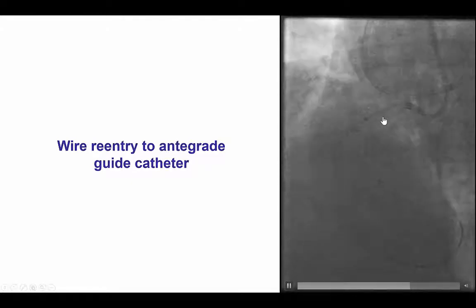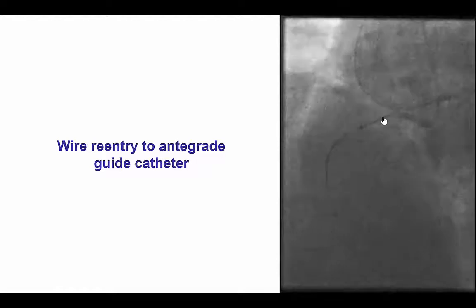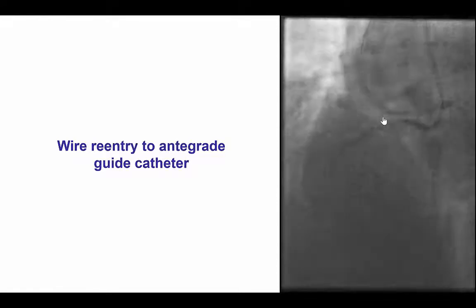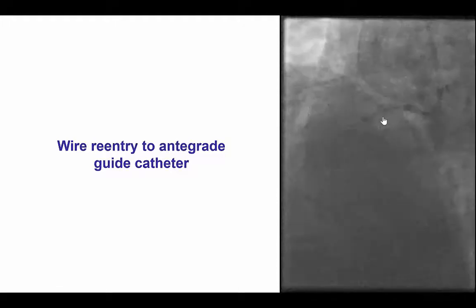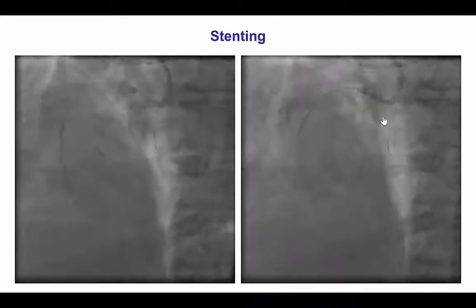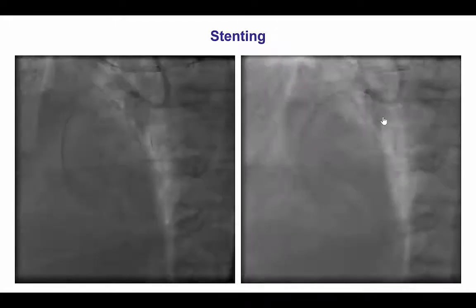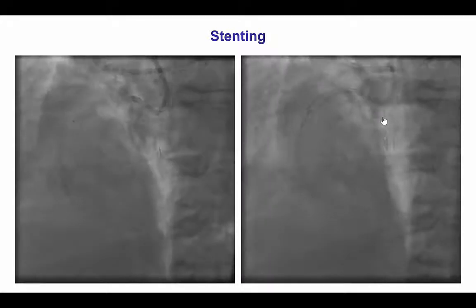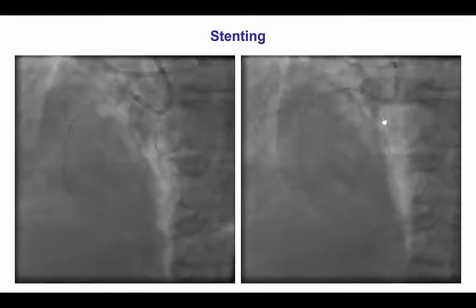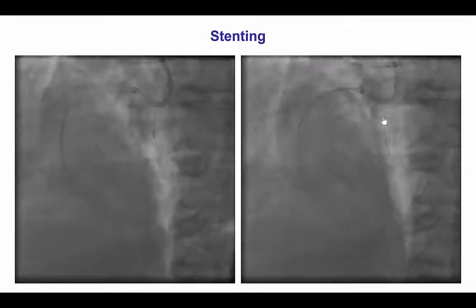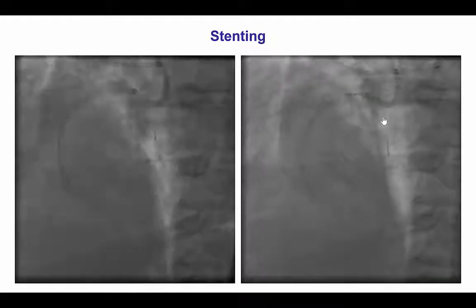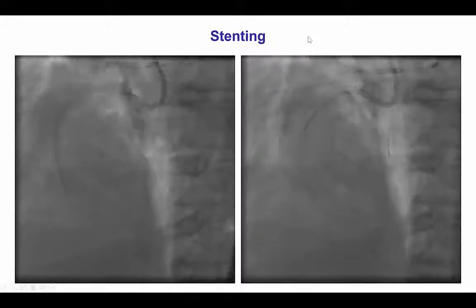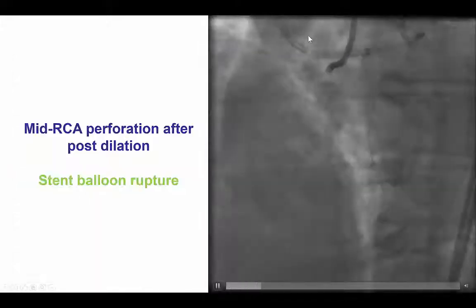After doing that, we were able to externalize the guide wire, and at this point we thought that the case was done. We predilated and then placed two drug-eluting stents.